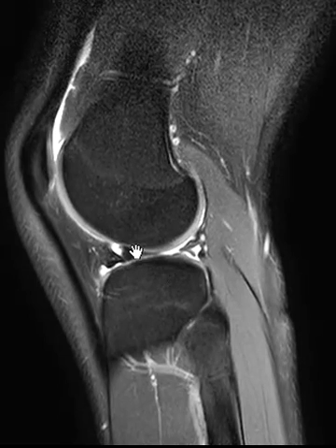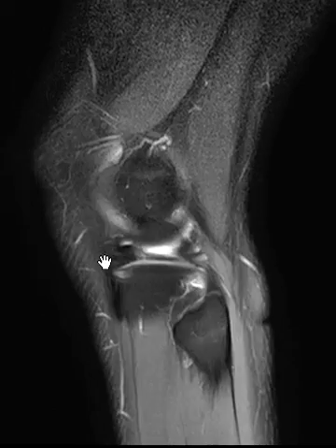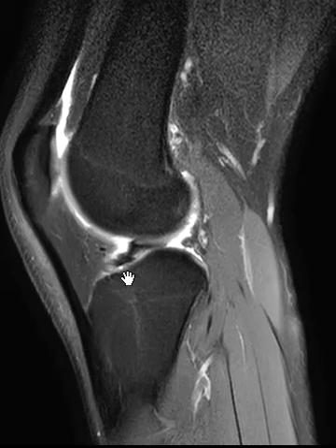You can see that the anterior horn is duplicated — there are two anterior horns. This is the real anterior horn, and this is another one here. This is the posterior horn that should be here, but it is flipped into the central and anterior portions, displacing the anterior horn. So just a quick and simple case of a bucket handle tear with a large, displaced bucket handle fragment.